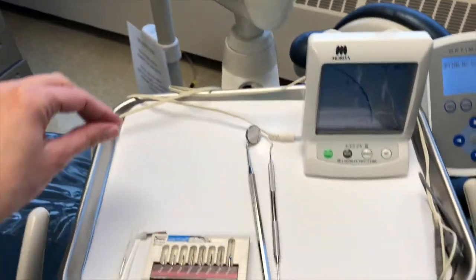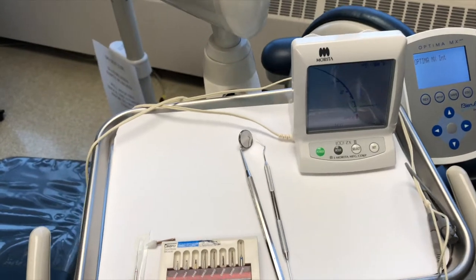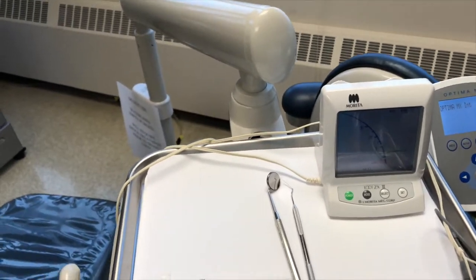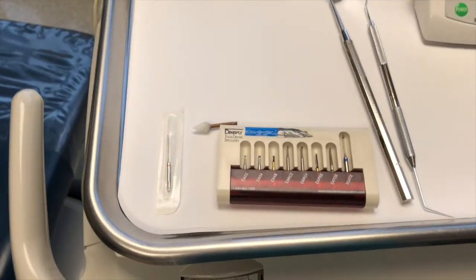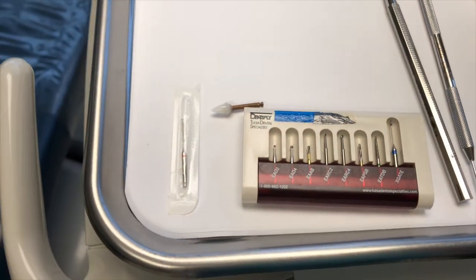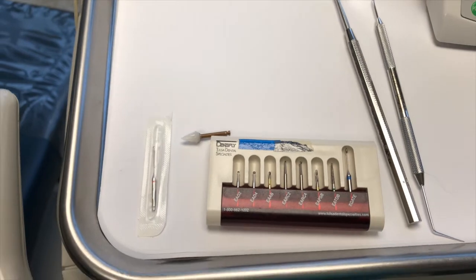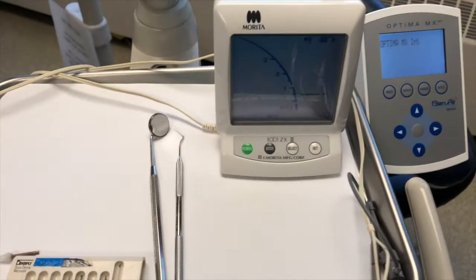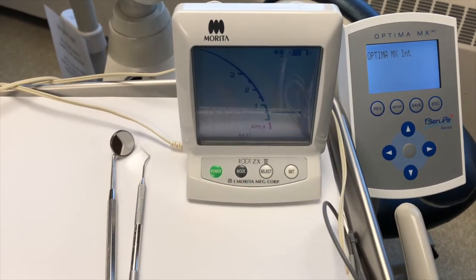Now I just want to review my operator table setup. I always have my mirror and my endo explorer. I prefer the mirror with the ruler on it because that's how I measure my files. Then we have our endo access kit, and I also have a Mueller burr there for troughing, and a polishing point for near the end of the procedure. I always keep my Root ZX — or my apex locator, whichever brand I'm using — on the tray.